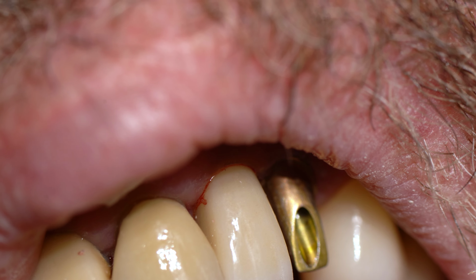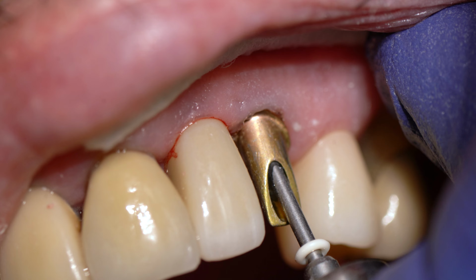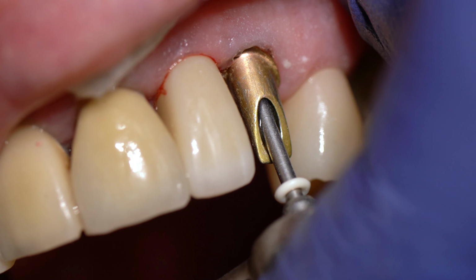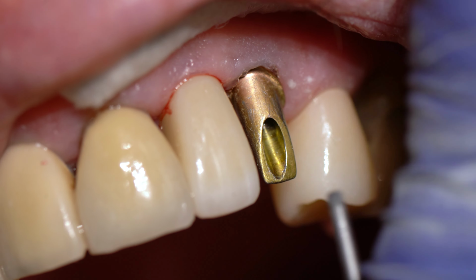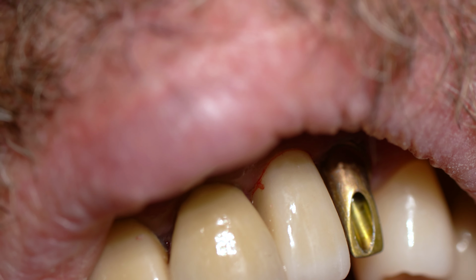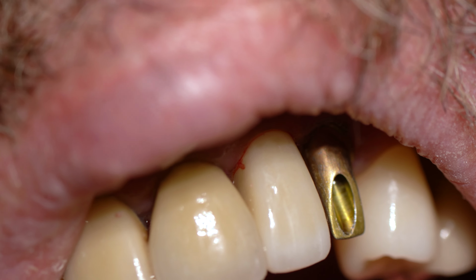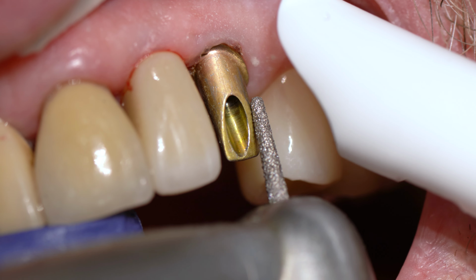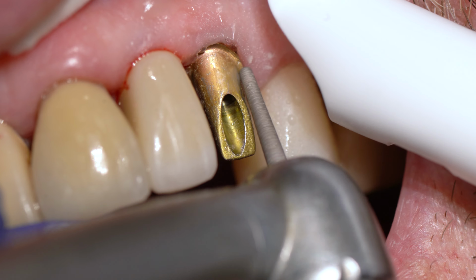So I'm actually just going to deliver this abutment, so that way my patient has something to go home with. I'm going to deliver this anodized abutment. I'm torquing it down right now because there are a couple of different ways to manage this. You can just take a new impression and send the patient home without a tooth there. But oftentimes you'll find that you don't want to do that, and your patient doesn't want to do that either. So instead, I'm torquing down the abutment, and I'm going to prep this abutment.